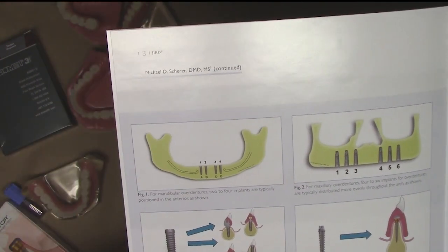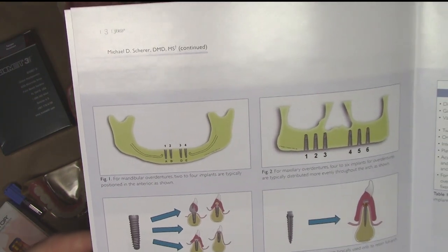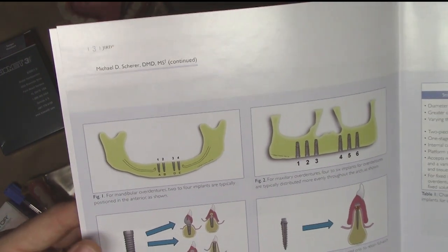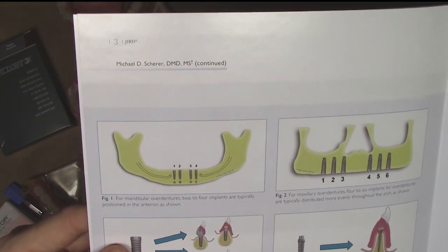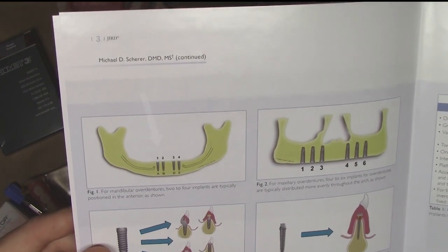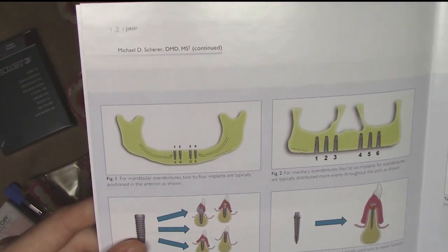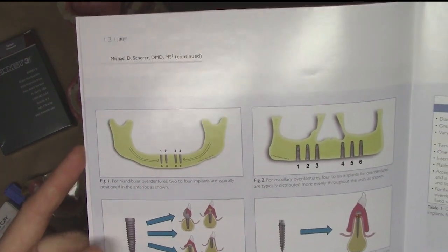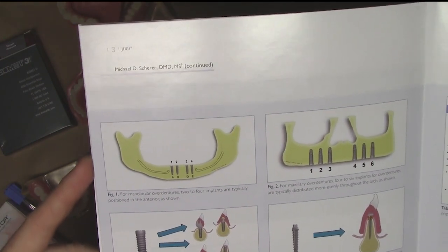Also, the principal reason why we typically designate the anterior mandible is that most of our patients seeking overdenture therapy have heavy resorption in the posterior mandible, precluding the ability of using either a standard or narrow diameter implant there. In the anterior mandible, we almost always have adequate bone in terms of at least bone height, and also in regards to the safety of the anatomical structures. But many times what's a limiting factor is our bone width. Hence the indication for narrow diameter implants, especially in situations with narrow ridge widths.